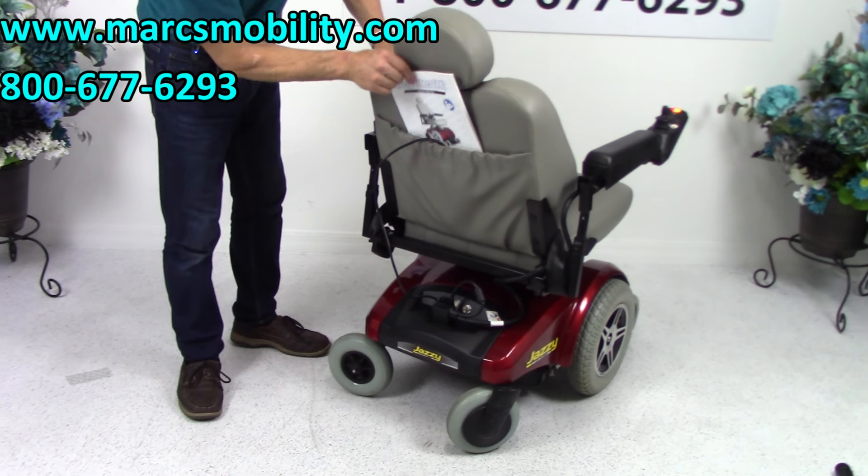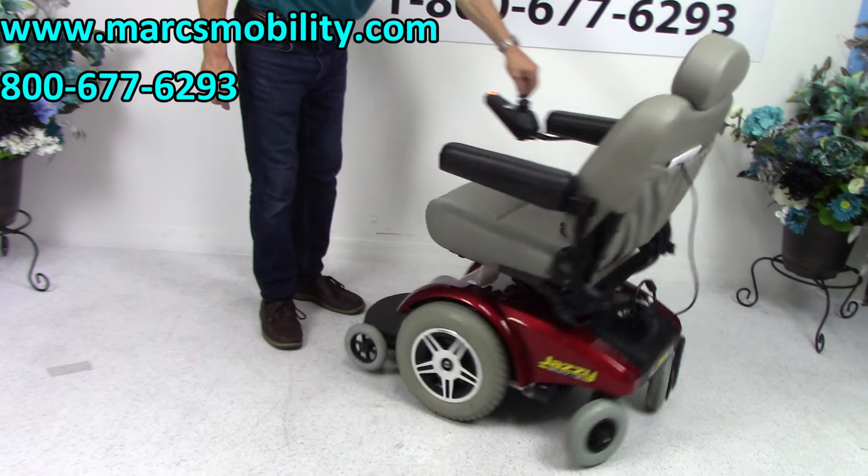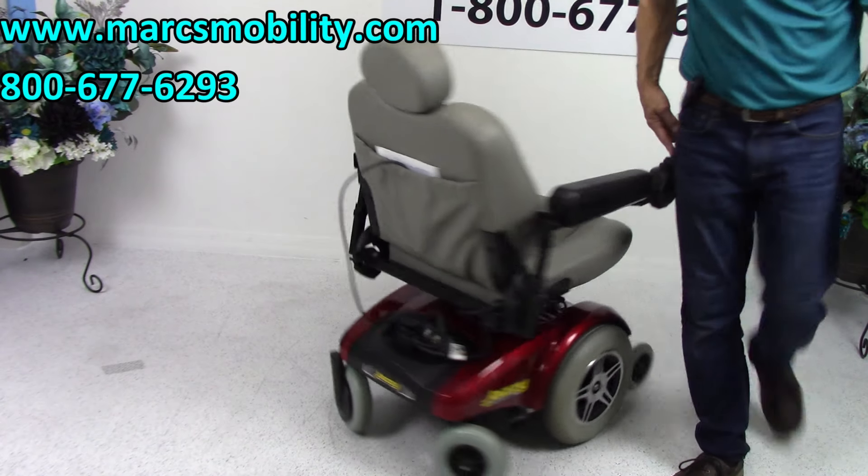You have an owner's manual that comes with it. It has a really good turning radius, so if you're in a house with it, it'll turn just like this all day long.